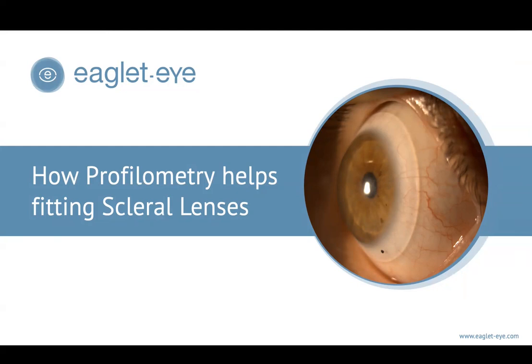These are cases to really highlight the kind of breadth of what the ESP is capable of, what profilometry is capable of in terms of how it helps us to fit contact lenses. And one of the cool things that I've really dug into more in the past couple of years is sclerals. That is what we initially thought of when we look at comprehensive ocular shape with these tools that go beyond the cornea. But the reality is that we really should be using comprehensive ocular surface topography for really any contact lens design.